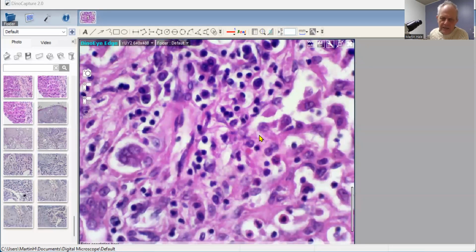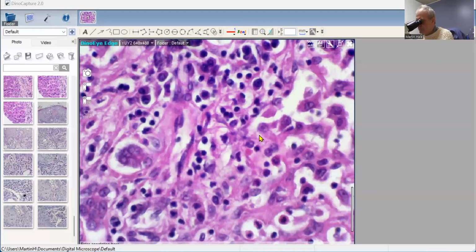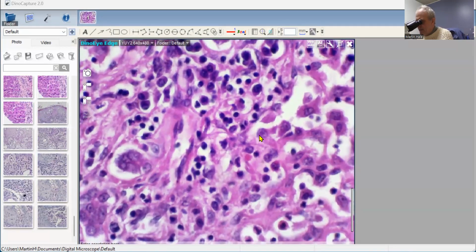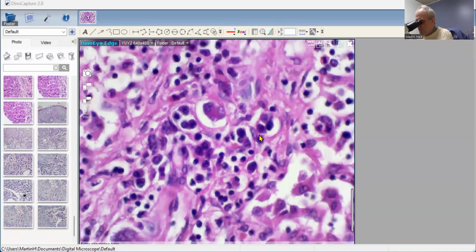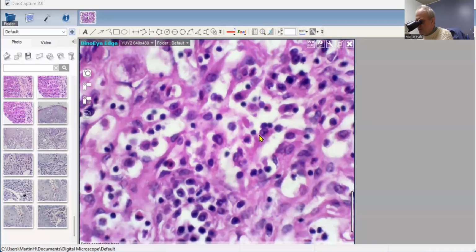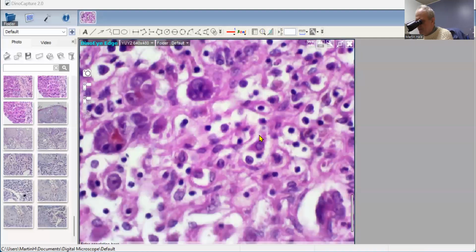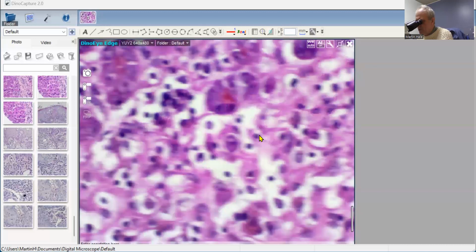So the differential diagnosis here basically amounts to 2 diseases. The first is autoimmune hepatitis. She is 11 years of age. We have seen patients with acute fulminant hepatitis secondary to autoimmune hepatitis. And the second one is hepatitis A, acute fulminant hepatitis A infection. And that's in fact what this is. So this is submassive necrosis secondary to fulminant hepatitis A infection. And absolutely classic. And I thought I would show it to you.